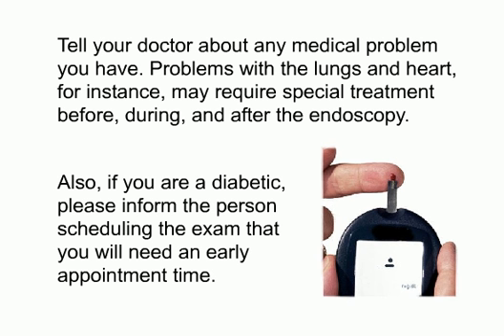Tell your doctor about any medical problem you have. Problems with the lungs and heart, for instance, may require special treatment before, during and after the endoscopy. Also, if you are a diabetic, please inform the person scheduling the exam that you will need an early appointment time.